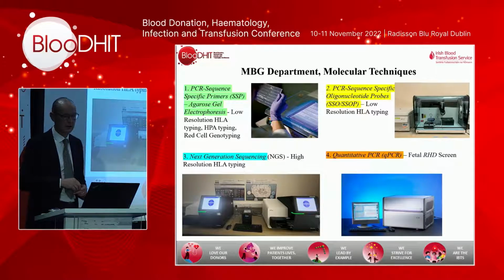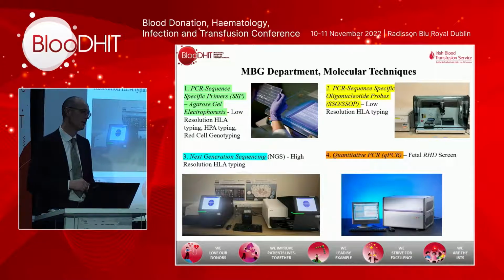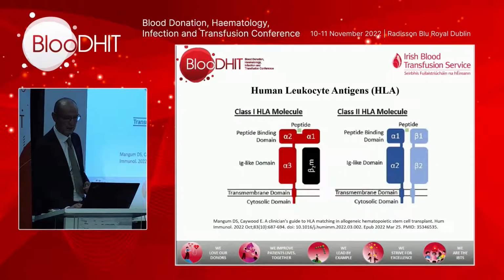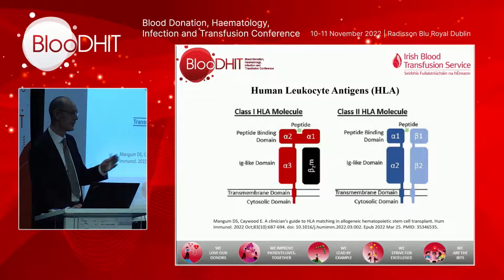And then the final new addition in terms of the fetal RHD screening is we do quantitative PCR, qPCR, for the fetal RHD screening. So these are the slides I'm just going to move quickly through in terms of HLA molecules. Most of us are familiar. For anyone who wants to know more, I'm available over the next 2 days to have a chat through HLA with you.